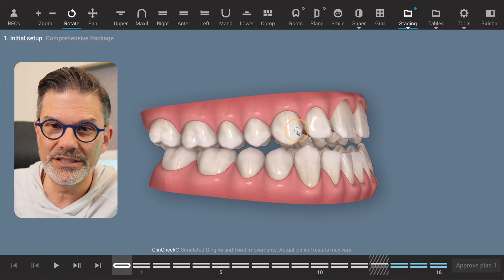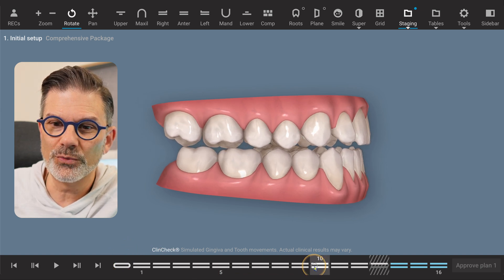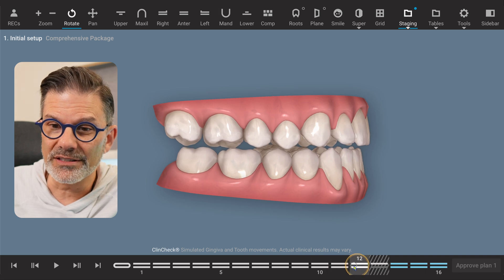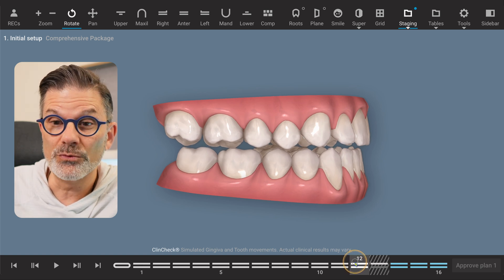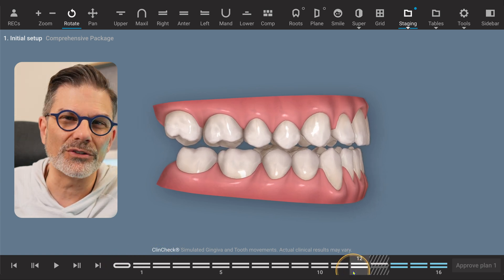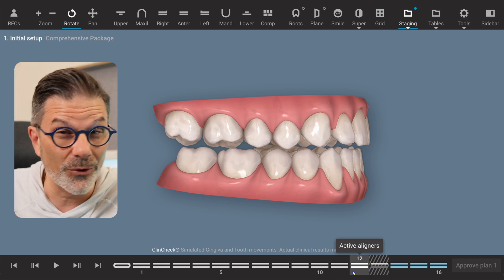In this case, as you can see, if we look at the movements being done, we are combining movements — everything at the same time — which is already a mistake. We're intruding the posterior teeth and extruding the anterior teeth simultaneously. Extremely difficult. You have to stage your treatment. If we're intruding the posterior teeth, everything else should be anchorage. If we're extruding the anterior teeth, everything else should be anchorage.